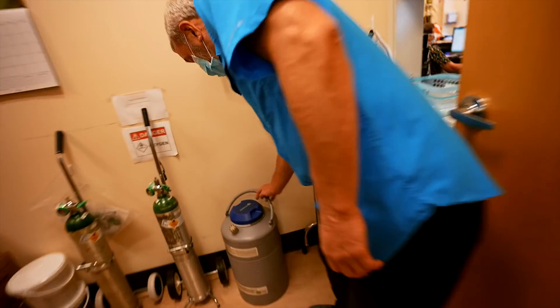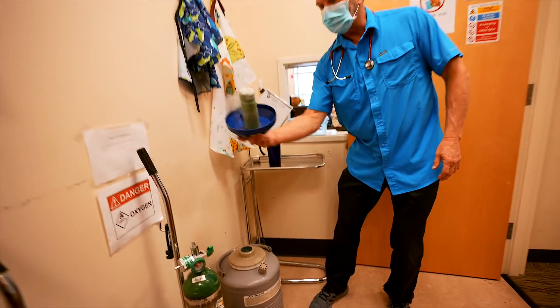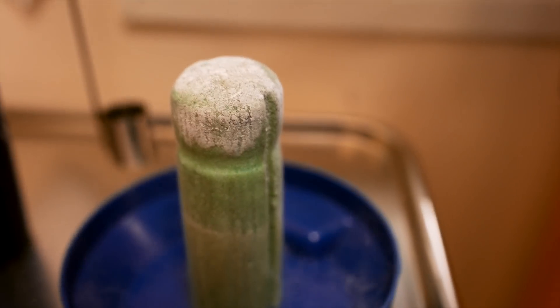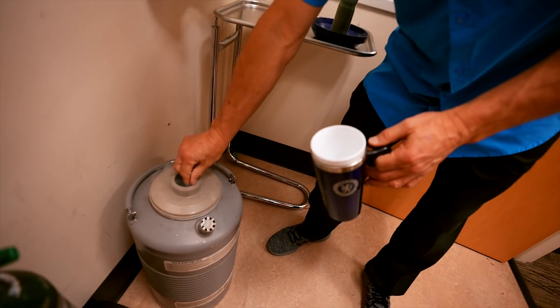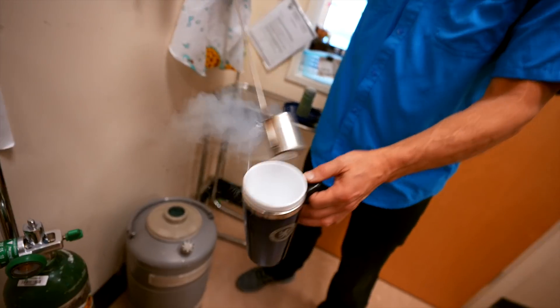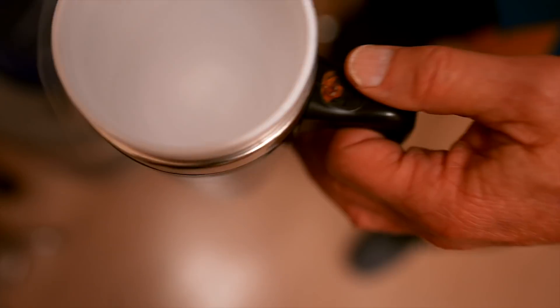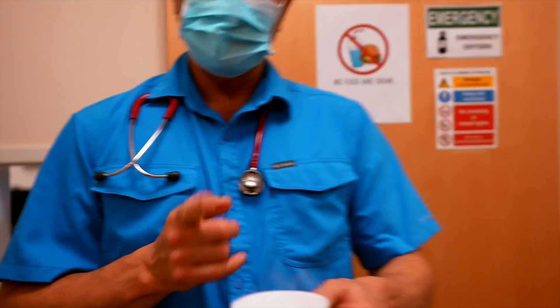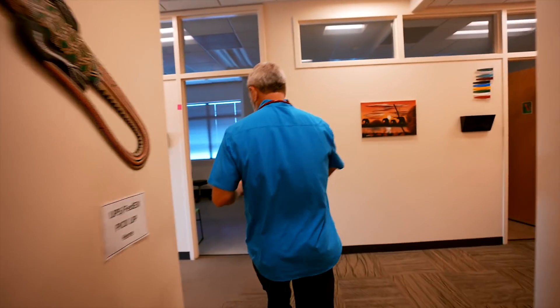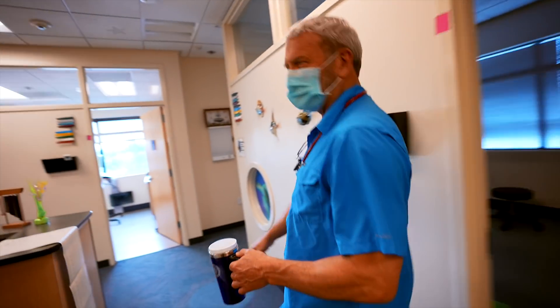So this is the container for liquid nitrogen. Now, it is a liquid that is so close to the vapor point that it can just evaporate almost instantly. This is the only legitimate use for styrofoam right here. You can recycle it — they pay you by the pound. Styrofoam? No, just joking.